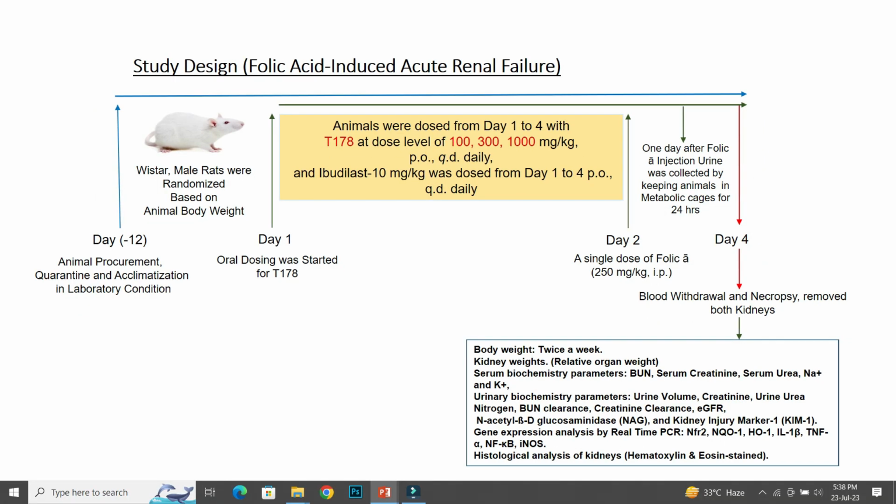Before adding all the animals, we have to give the doses of drug treatment, and we have to give water twice, double their dose, so that they can produce the required volume of urine.